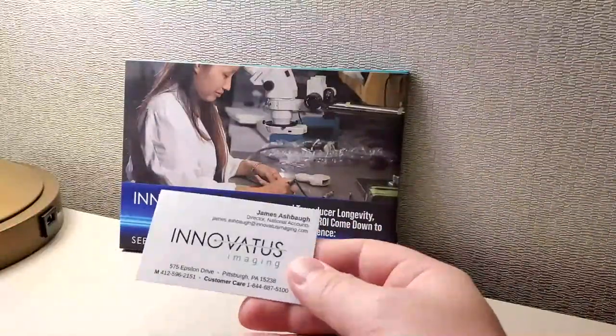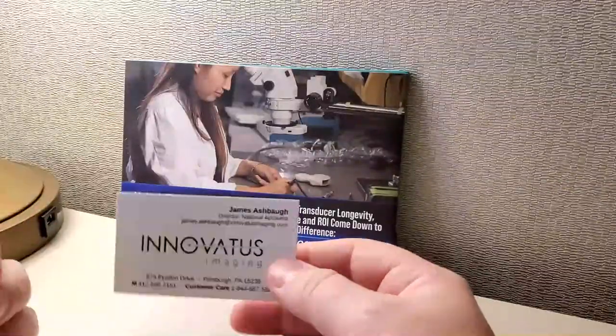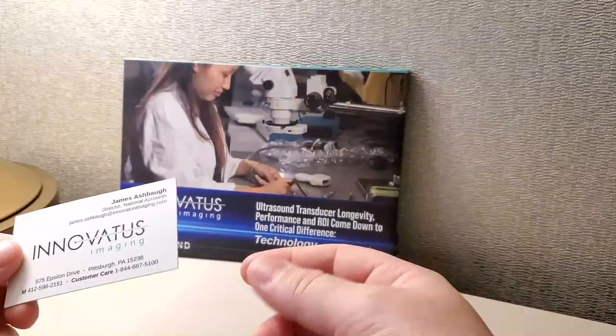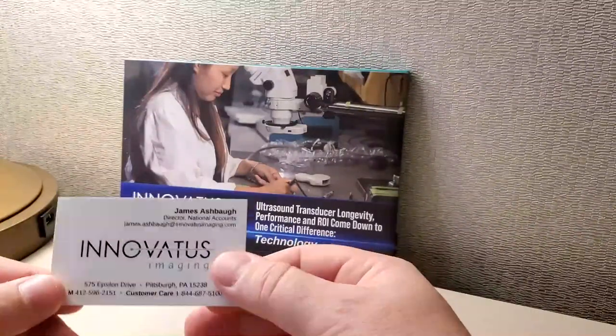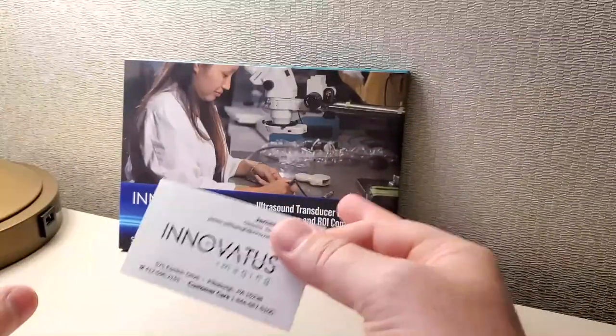Sorry about my voice. I've talked so much today that my voice is starting to go away, unfortunately, because I have had such a pleasure talking with everybody. One of the people I stopped and had a nice long conversation with was James from Inovatus Imaging, and these guys actually remanufacture imaging probes.